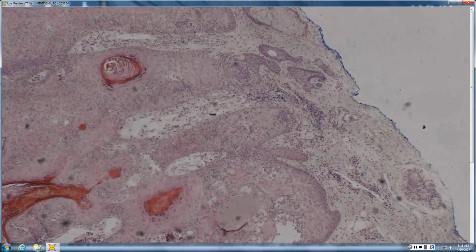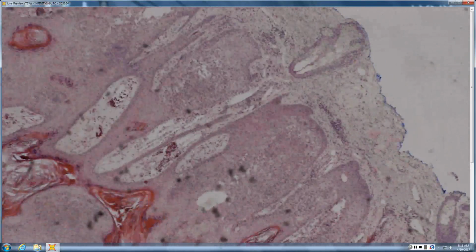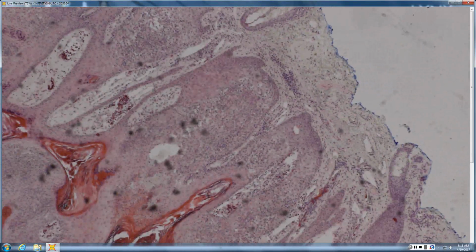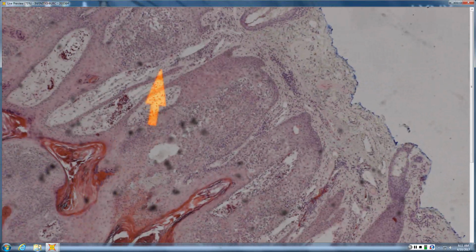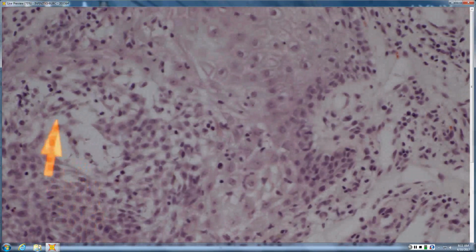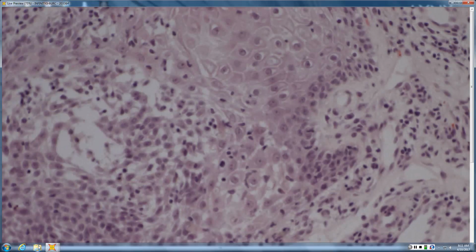Hyperplastic epidermis. Some. I don't think I see any pseudohyphae. Is there acantholysis in there too? So there are definitely pseudohyphae. There is. So if it were acantholysis, the cells would be round. Are they round or are they stretched out, hanging on with long, thin extensions? More the latter. So it's more like just extreme spongiosis.